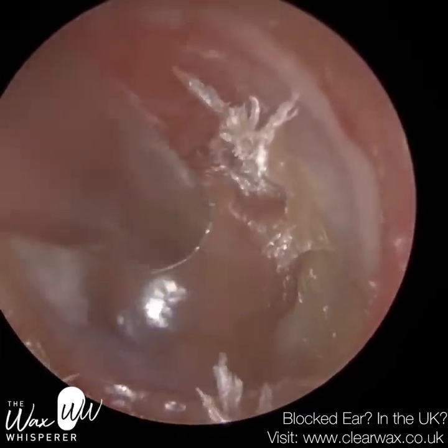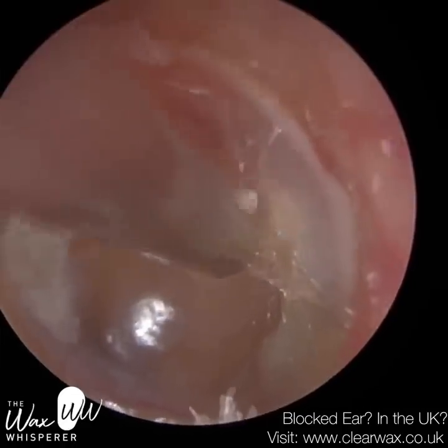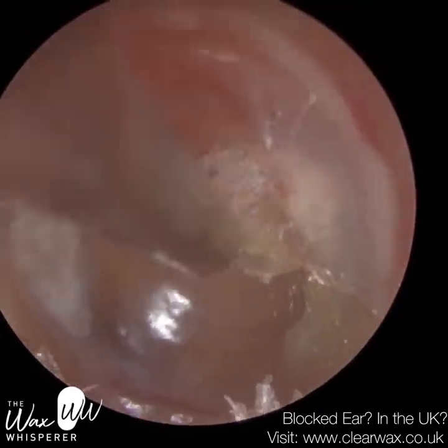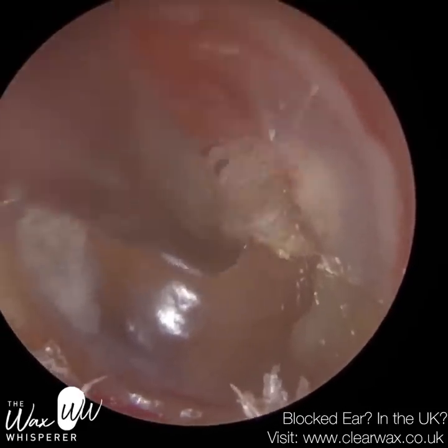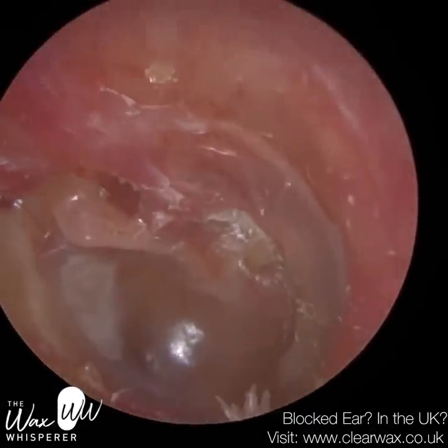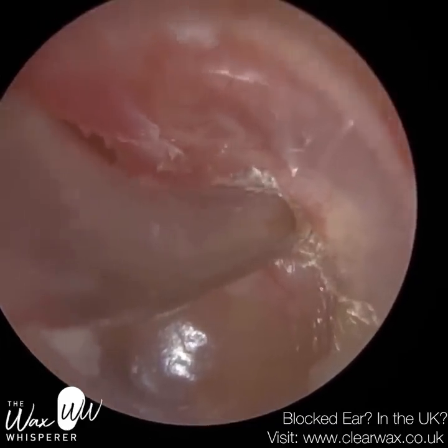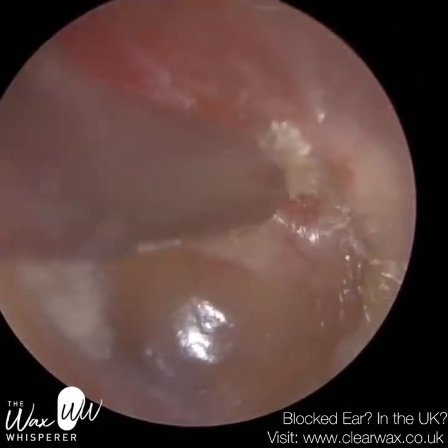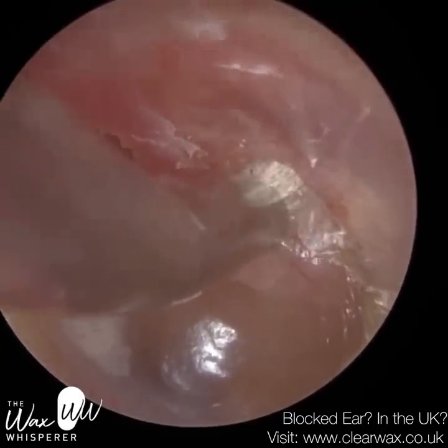So just some dead skin here. I want to remove as much dead skin as possible. There is a secondary retraction with some skin still there, and I tried my best to remove it, just slowly peeling it away. I don't want to use any drops here just to loosen it because we just don't know what's behind it — I don't want drops to get into the middle ear as that can lead to a middle ear infection. The patient could hear so much better after removing this, to no surprise because you had this crusted dead skin. Was that a cholesteatoma? I'd probably say no because it's not infected. I would say it was on the verge of developing into one — at this stage it's just dry keratin that had got trapped in retraction.